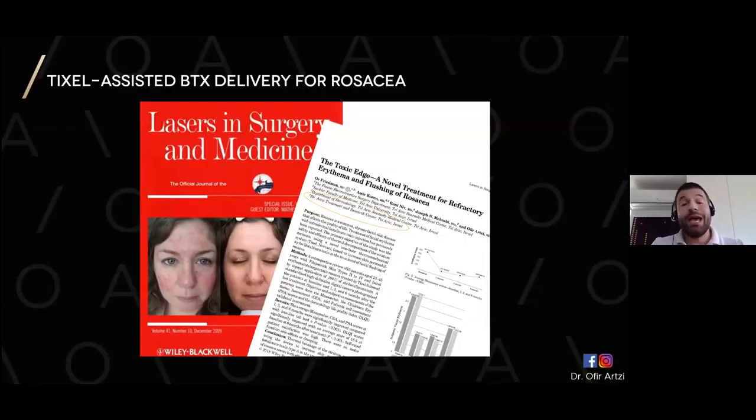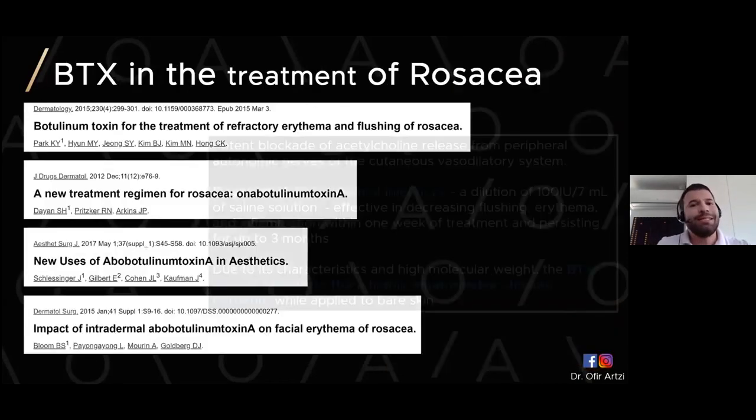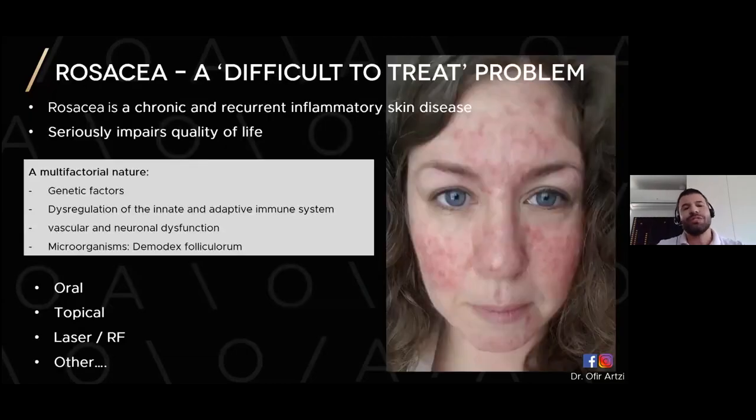Another area in which we have a few years of experience is the treatment of rosacea with Tixel. Again, this is a publication from 2 years ago, and it all started with this patient. This patient was resistant to all modalities. We tried every modality in the literature. As you can see, we tried oral, topical, we even tried IPL and pulse dye laser. We had some minor improvements, but in general, it always recurred.